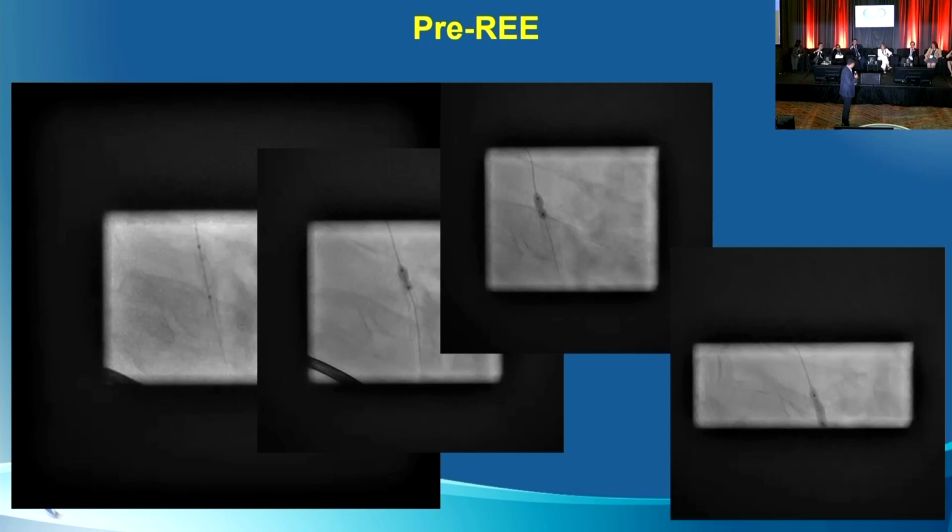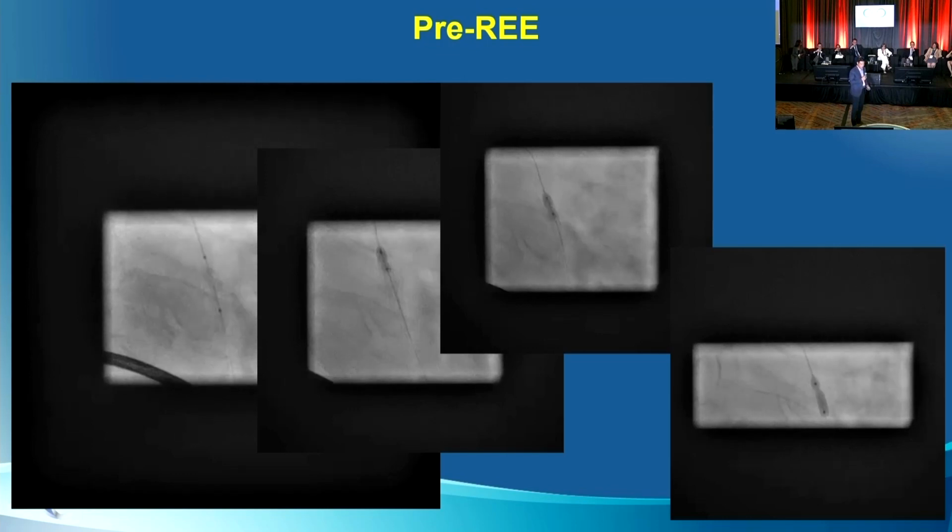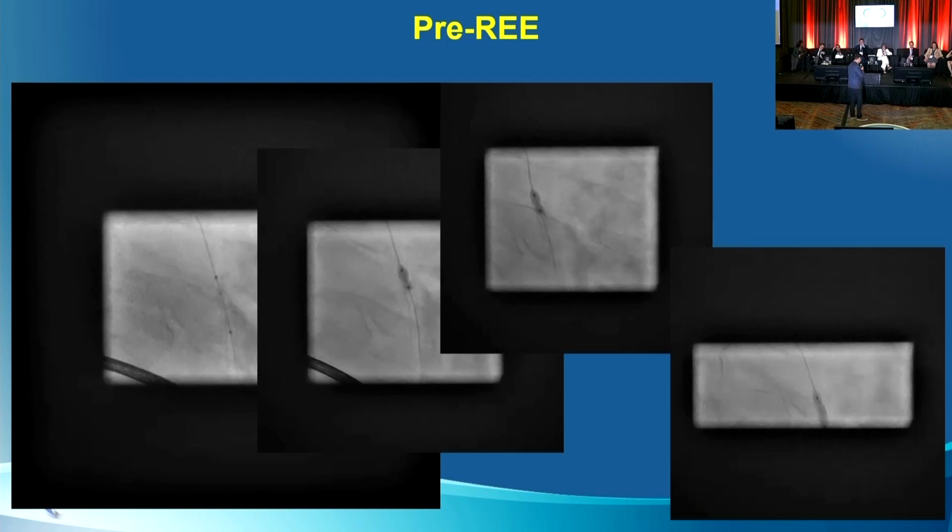Let me interrupt you if you don't mind. Do you think that very focal area was missed on the pre-dilatation balloon? The pre-dilatation balloon was distal to it, maybe, or at the tapering of the balloon, because you would think you would have seen that. Yeah, I don't think so, though. We looked at that pretty closely, and we covered the area for sure. I agree, though. We didn't see it, but we're obviously seeing it with the stent. And you did it in two views? I would like to think I did orthogonal views there, but I'm not exactly positive. But obviously, I see it now.